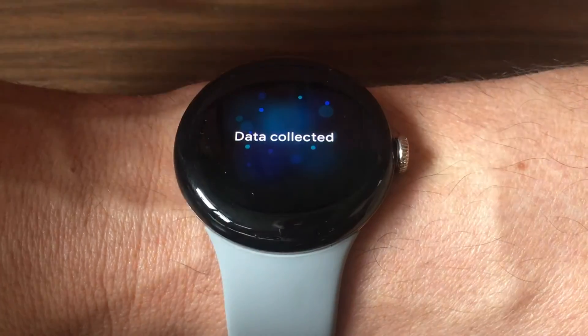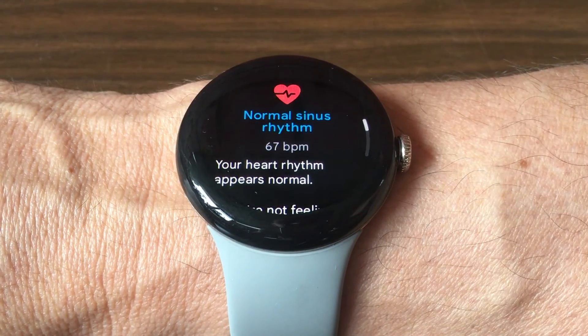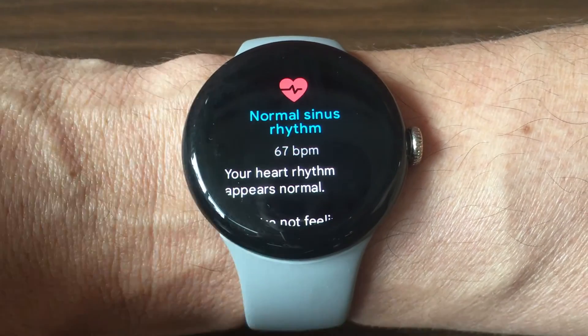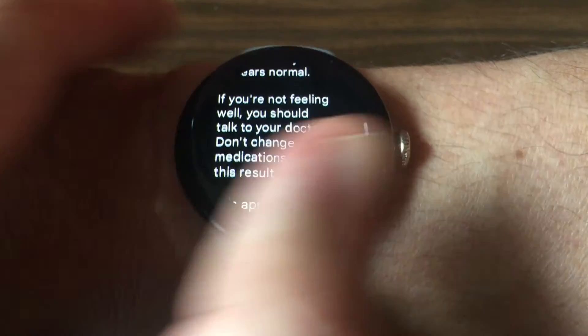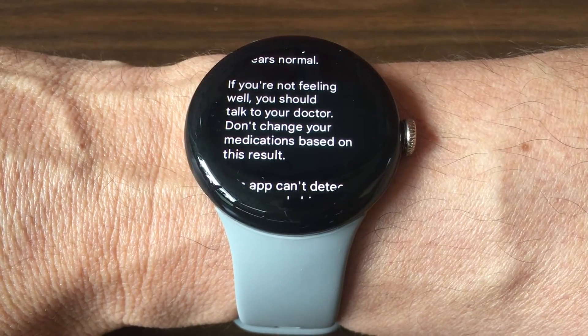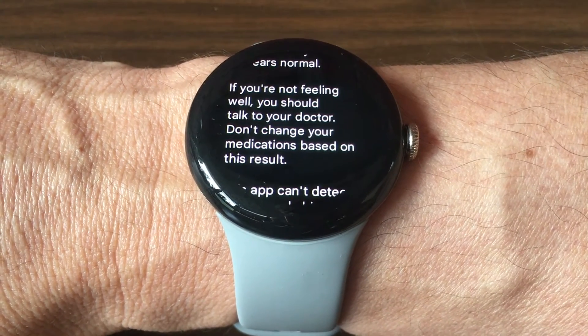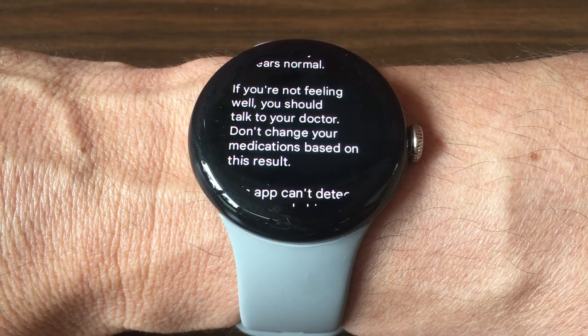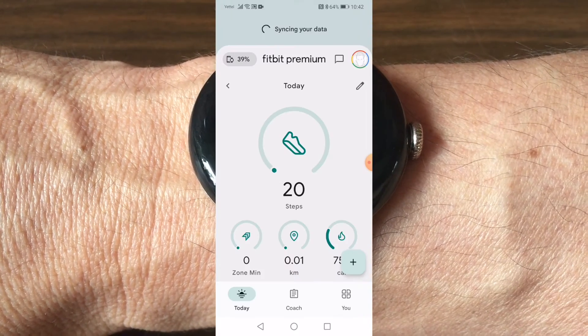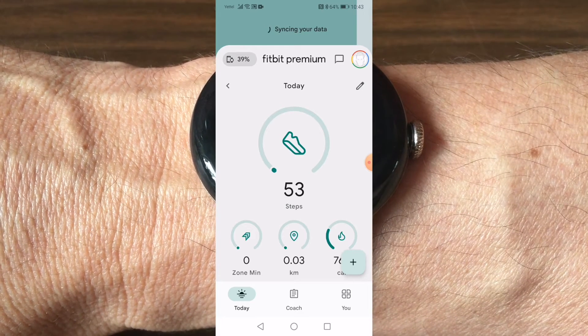Let's see if it'll succeed — there you go: normal sinus rhythm, 67 bpm, your heart rhythm appears normal. The repository for all these results is the Fitbit app.